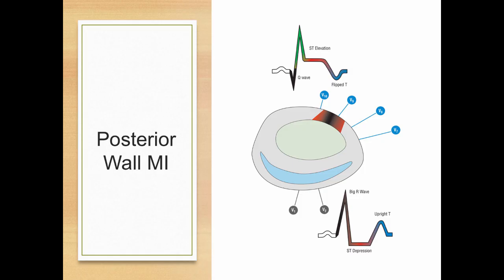Hopefully you're doing this on every patient. Sometimes there are time constraints, but hopefully you're doing it at every patient. But at the very least, if you see ST segment depression in V1, V2 in your septal leads, your reciprocal leads to your septal leads are your posterior leads. So pop those on real quick. It's just a few more stickers. Takes you an extra like 21 seconds to get a posterior 12 lead.